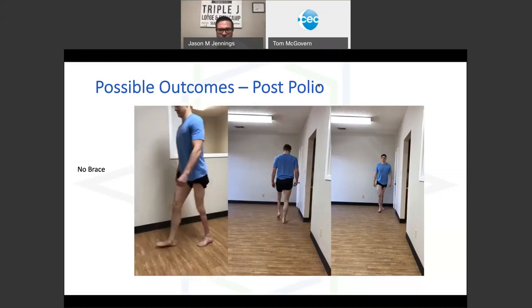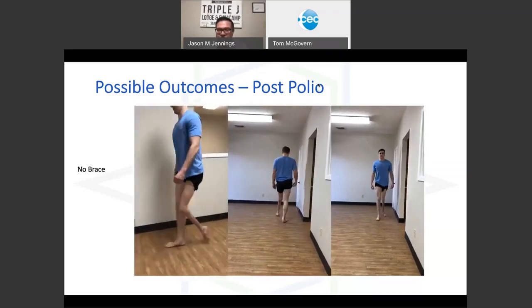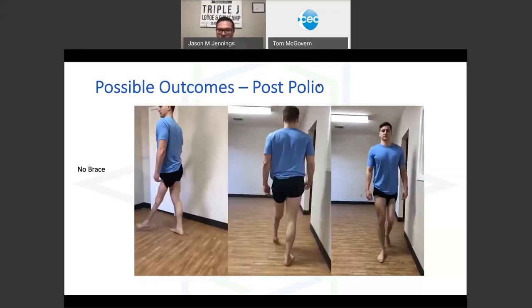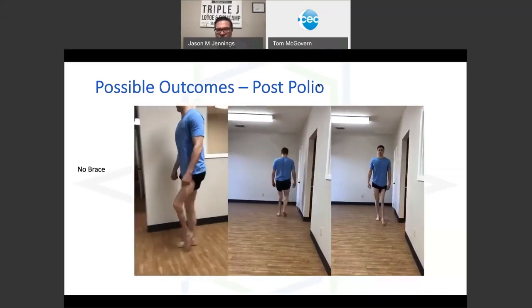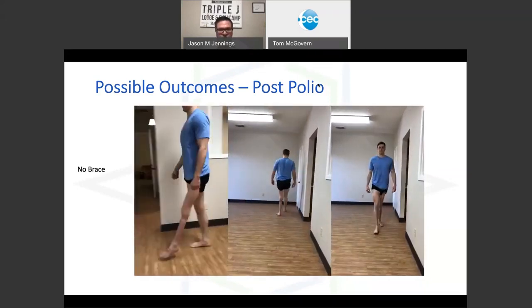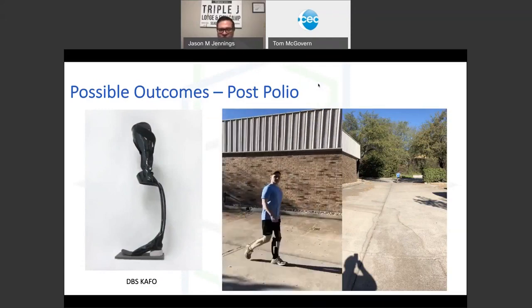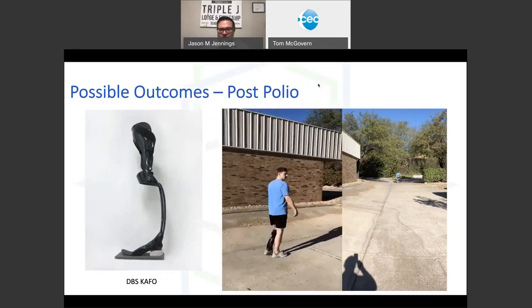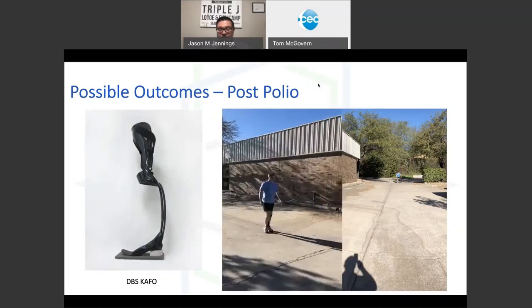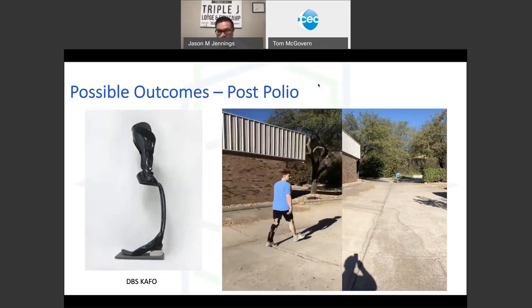He obviously has IRP or internal rotary patterning at the foot, ankle, and knee. He's completely flail from the knee down. He does have some quad with limited glutes. So I was able to manage him in a dynamic bracing solutions KAFO, similar to the one shown here. That's not his brace. But you can see we were able to smooth out his symmetry by reestablishing his leg lengths. Actually, he's on a 2.5-inch heel wedge within that shoe. His heel is basically sitting outside of the shoe.